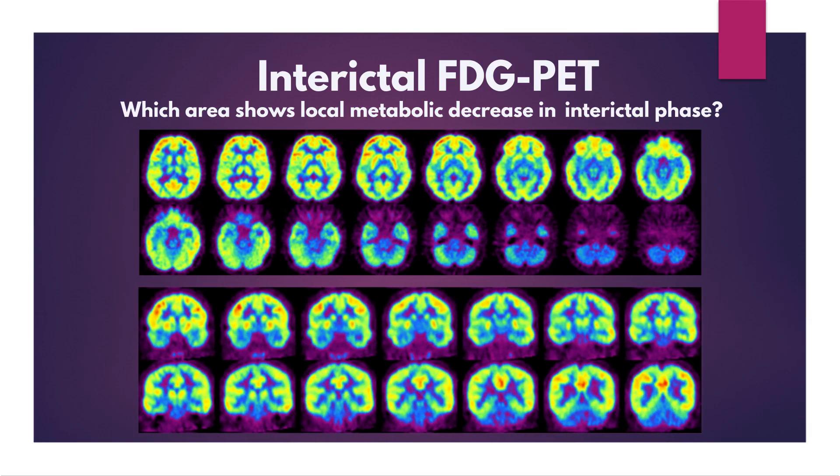This is a quiz case. FDG PET during the interictal phase in a patient with epilepsy. In which areas is there hypometabolism indicative of epileptic focus? Pay attention to the difference between the left and right accumulations and think for 10 seconds.